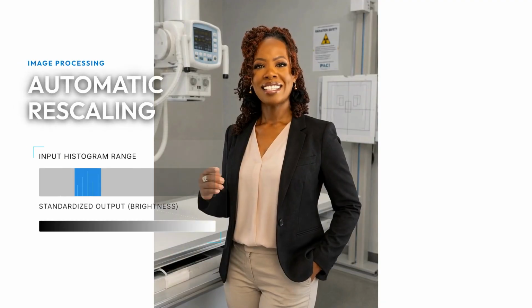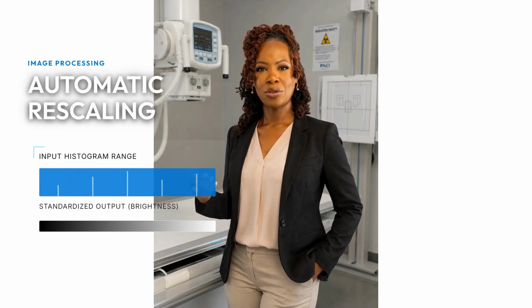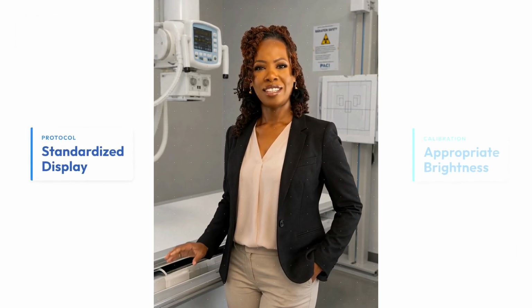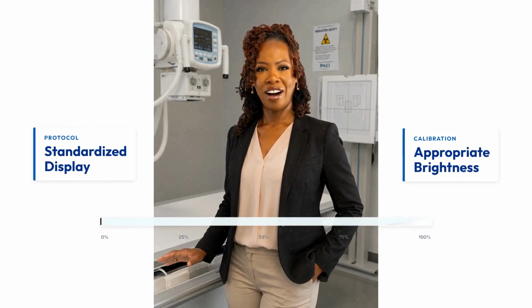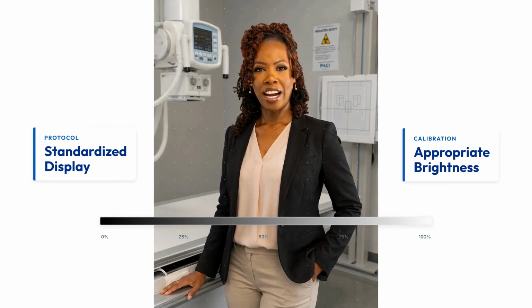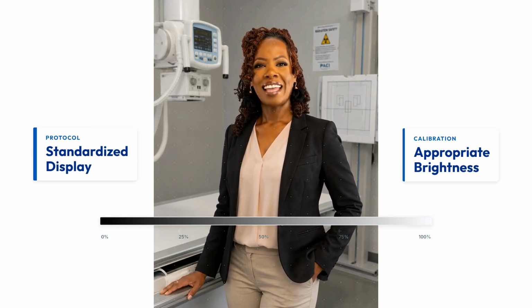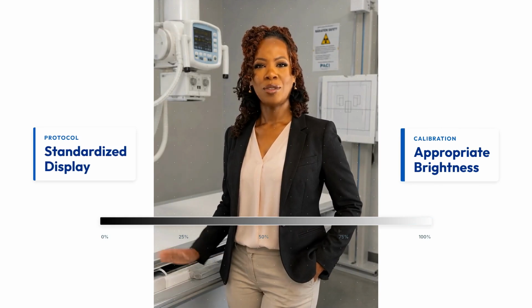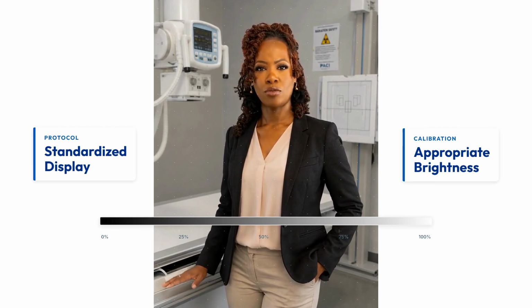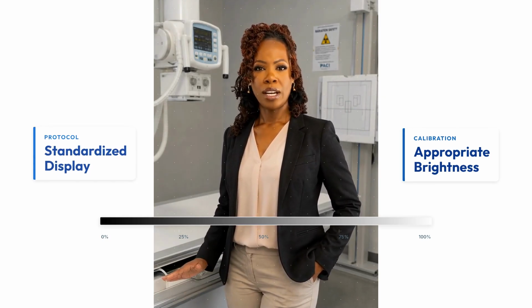Once the system has identified the relevant pixel values, automatic rescaling can occur. Automatic rescaling adjusts the useful pixel values identified during histogram analysis and maps them to an appropriate range for image display. This allows digital radiography systems to maintain relatively consistent image brightness across a range of receptor exposures, contributing to the system's wide exposure latitude.